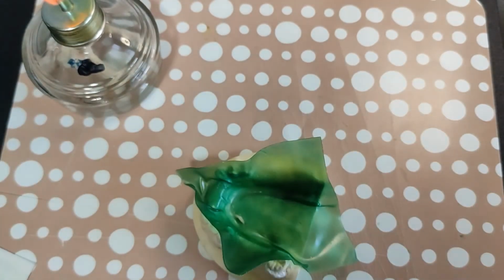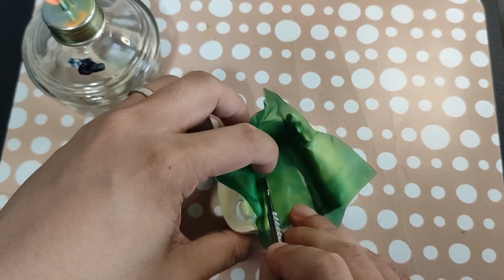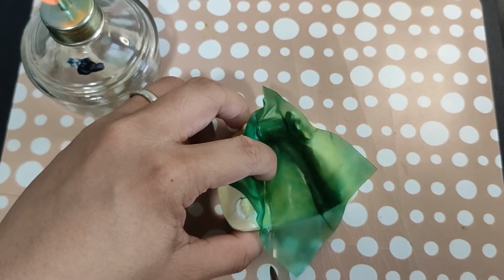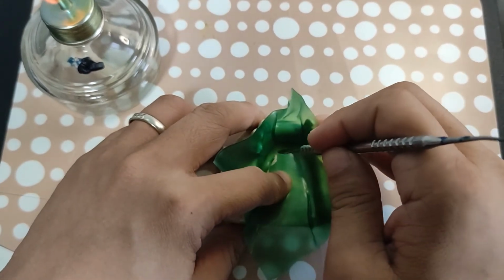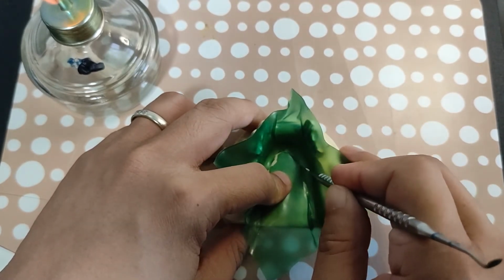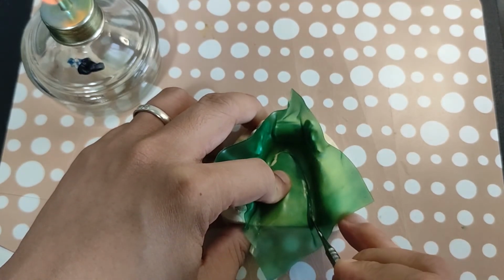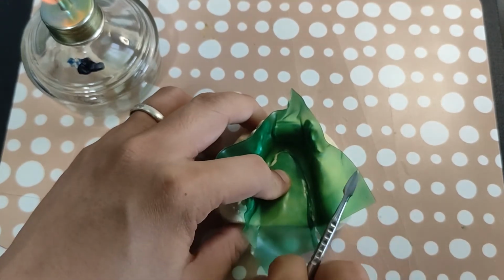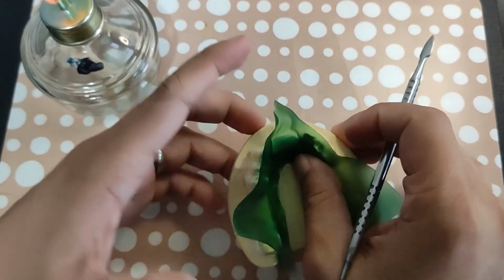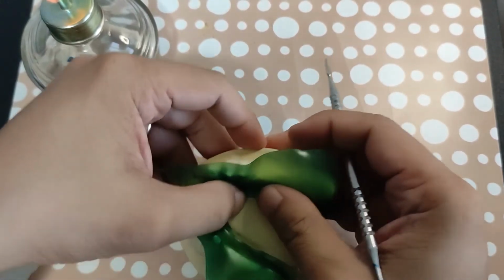And cut off the excess. We cover all the lingual mucosa.